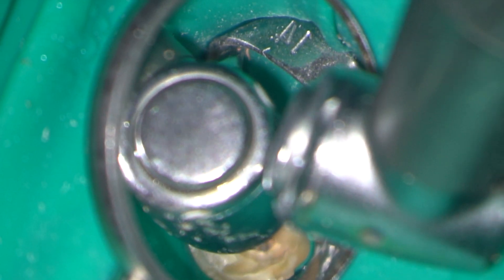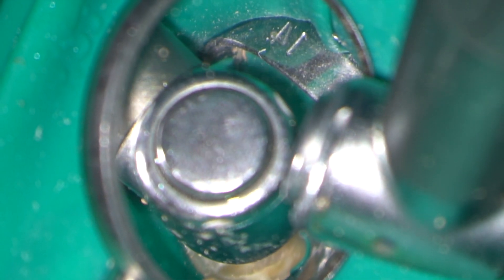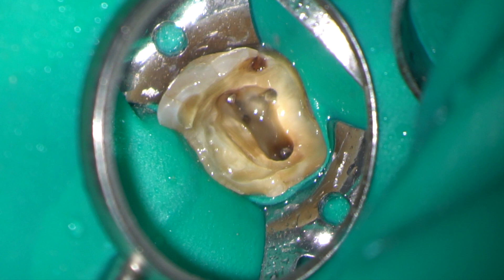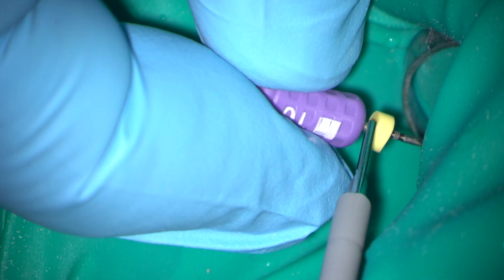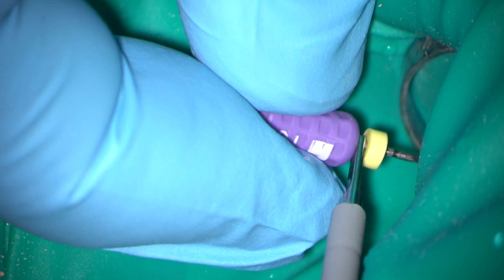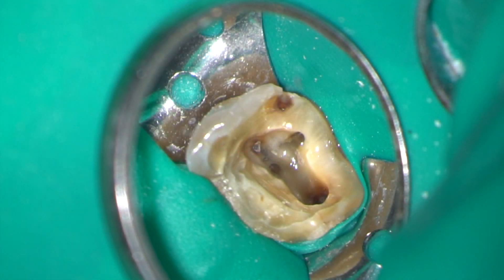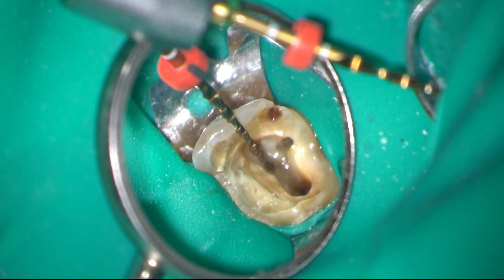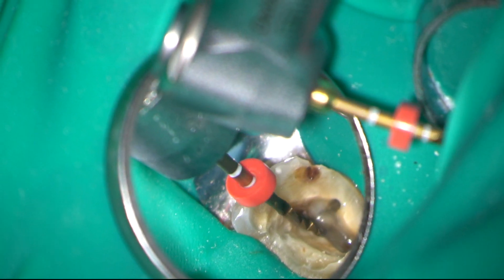Here I am rapidly removing gutta percha from the palatal canal using a Gates Glidden No. 2. I have now located the orifices of the MB2 and distobuccal canals. All root lengths are estimated using an electronic apex locator. The MB2, distobuccal, and palatal canals are all tapered to a primary Wave One Gold instrument.